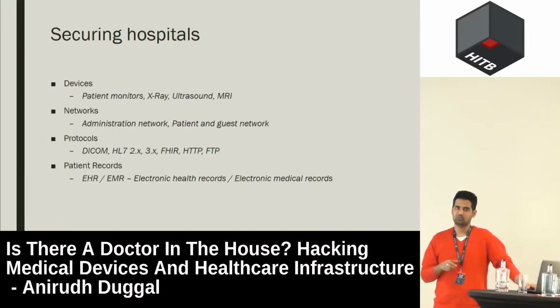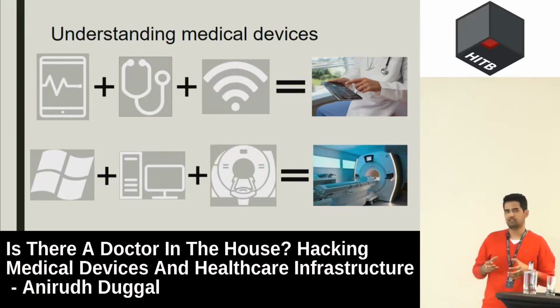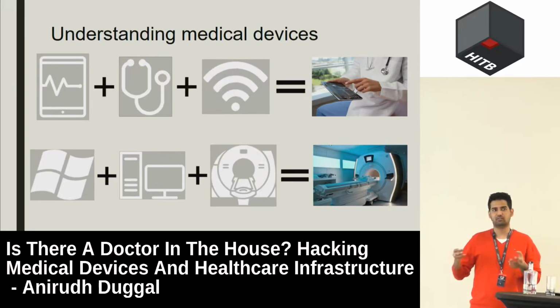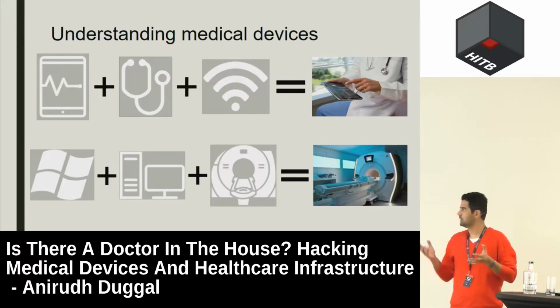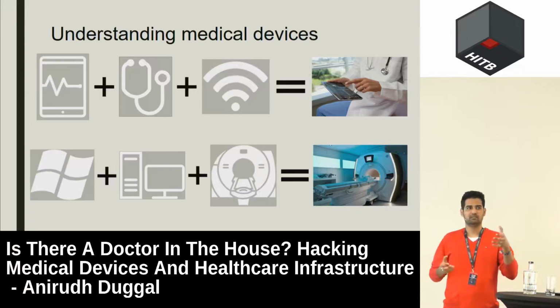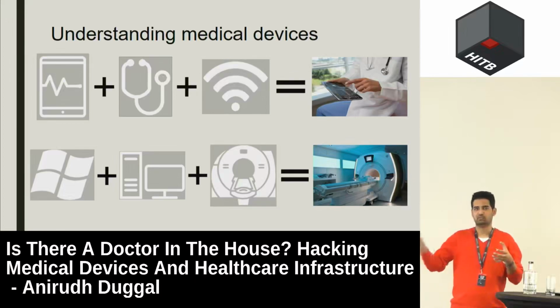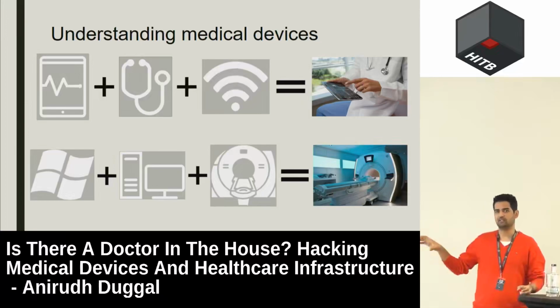For those of you who do not know about medical devices, this is what a medical device looks like. It's not something really obtuse or abstract. Most of the medical devices are stripped down versions of commercial OSs. If you have an MRI machine, or let's say a CT scan machine, it'll be Windows XP or Windows 7 or Windows 10, and then you put IIS over it, and then you have services, and then you package it as a medical device.